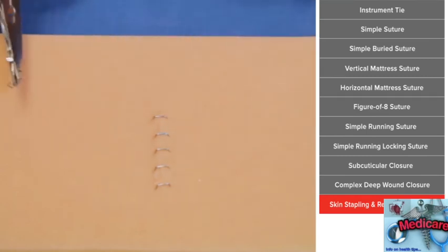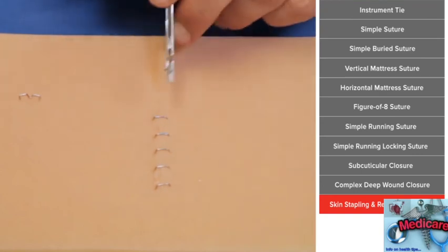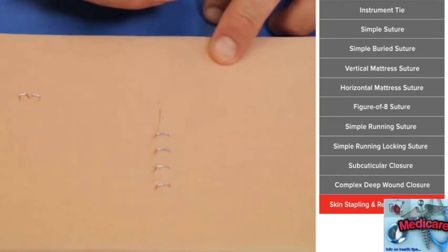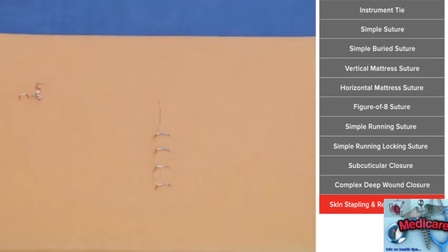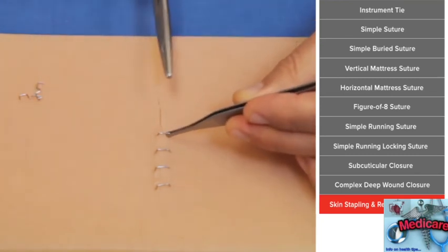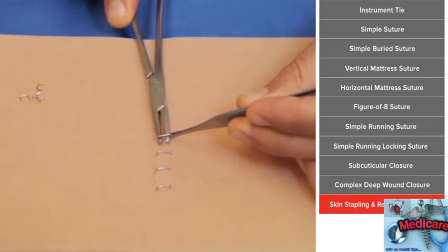If you don't have a staple remover, you can also use a needle driver or a clamp and place it under the staple and just spread, and basically spreading is doing the same thing. It's straightening out. This is much less painful for your patient though if you can use one of these devices, because as I said, it straightens everything out and simply pulls out, and there's no pulling. Sometimes if the bending apparatus doesn't really straighten them completely, you can just, as you're stapling, rock it gently.